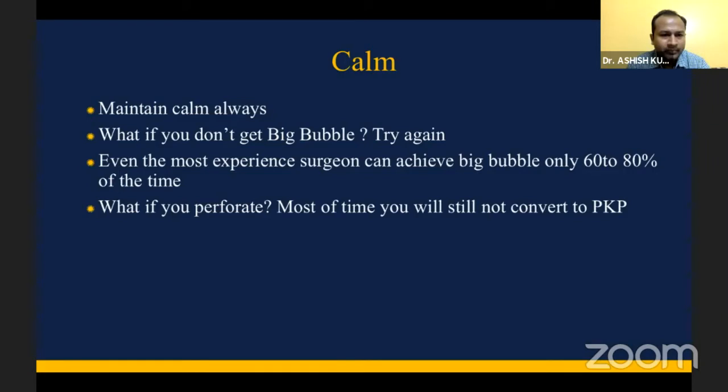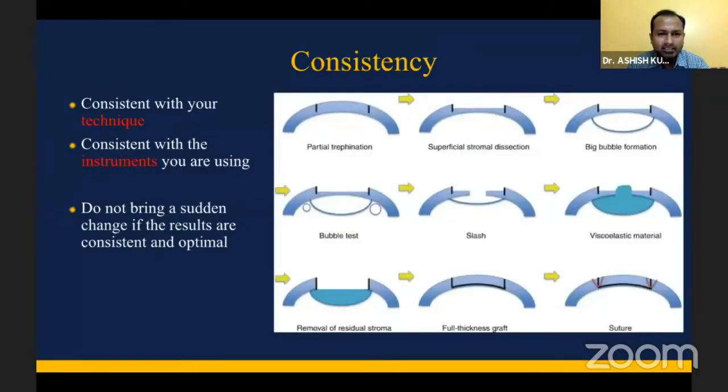And don't think, what if you perforate? Most of the time, you'll still be able to continue with the DALK. Very rarely, you need to convert to PK. Very importantly, be consistent. Be consistent with your technique and with your instruments. I'll be focusing mainly on instruments in this talk.